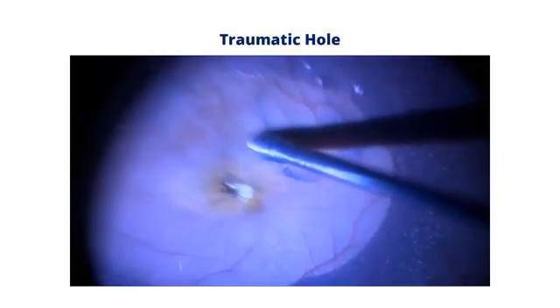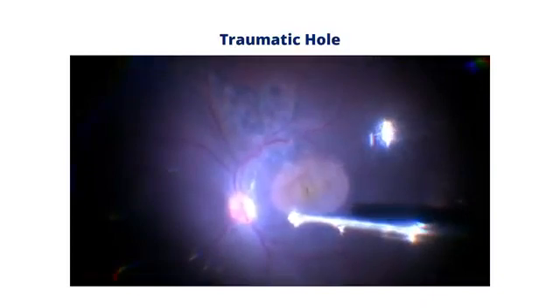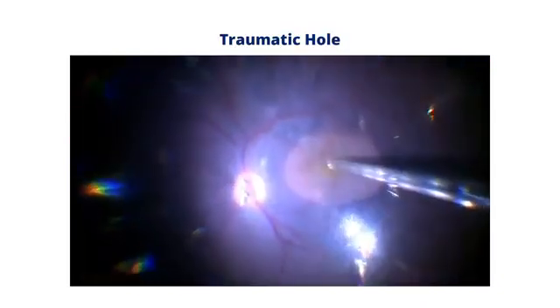Once this is done, we do air fluid exchange and then drain from over the hole, and you can see the hole becoming pinpoint and almost closing.